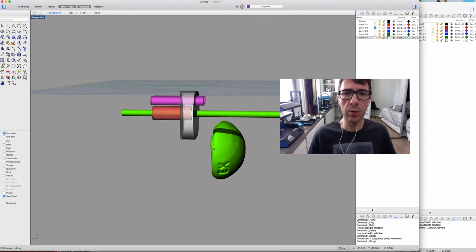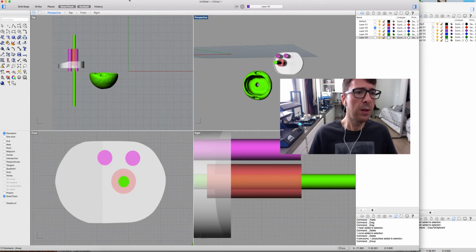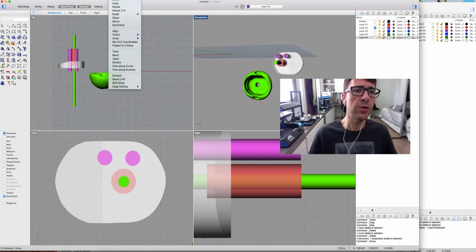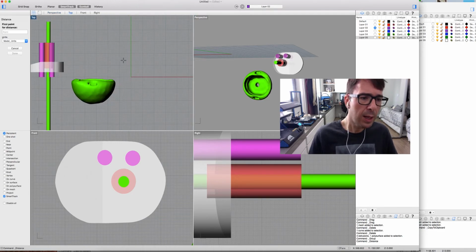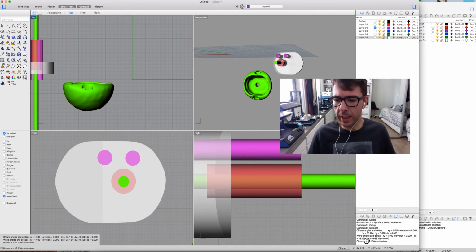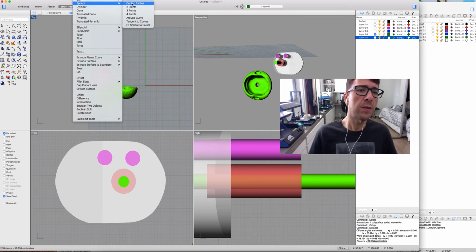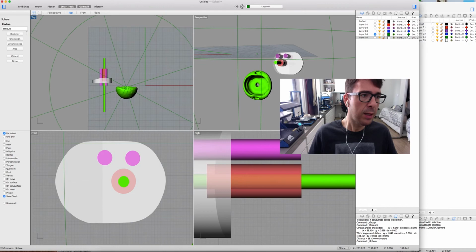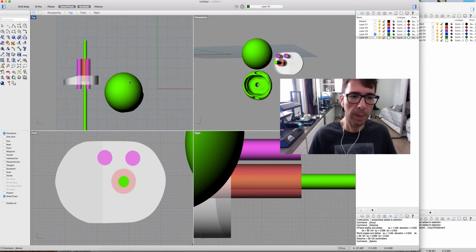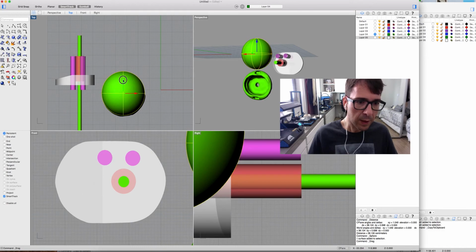In order to design the glenosphere, it's not that difficult. It's a simple sphere. Let's do it. Let's first measure, analyze. Let's measure the diameter. The diameter is 38, so we're going to create a 38 sphere. Let's change color to green. Green is okay. Solid sphere. Let's select right here. 38 diameter, 19. Okay. Now we have our sphere just as the glenosphere.